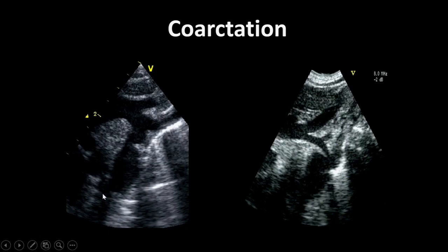Just a couple examples of coarctation. Here you have a discrete narrowing at the isthmus. You can also have this more diffusely hypoplastic transverse arch.